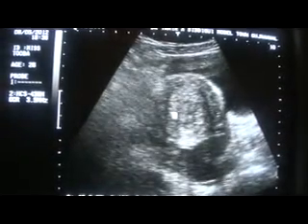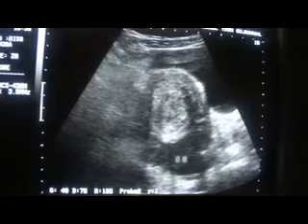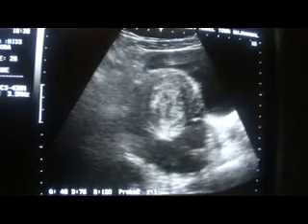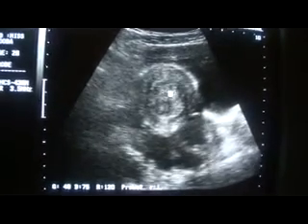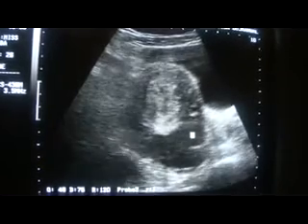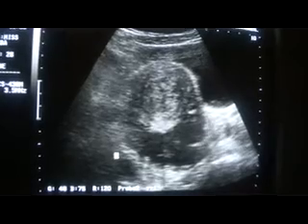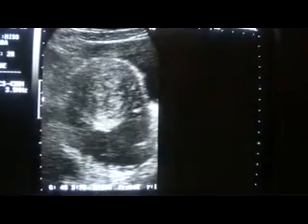So two possibilities regarding the uterus. One, this dilated endometrial canal filled with different strength internal echoes, thick echoes with internal tiny cystic areas. And the second will be a fibroid in the endometrial canal.